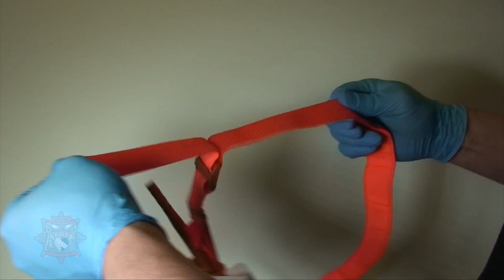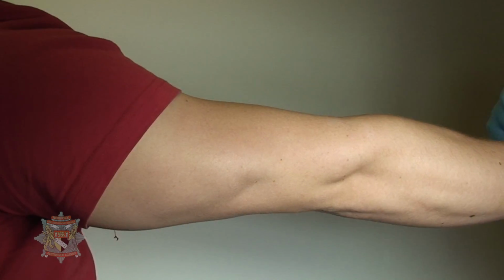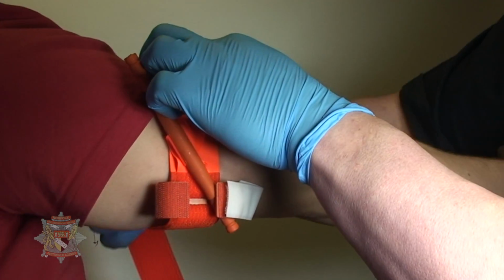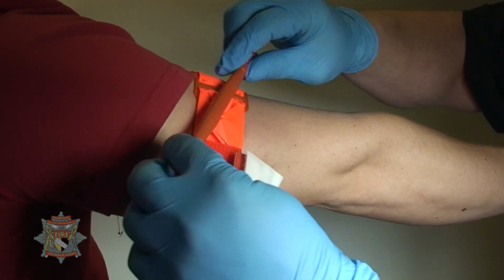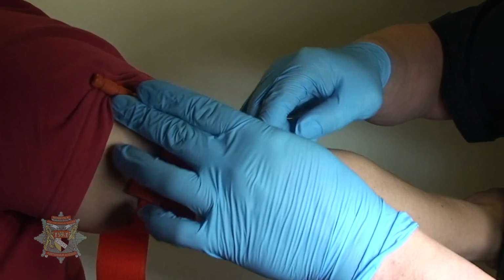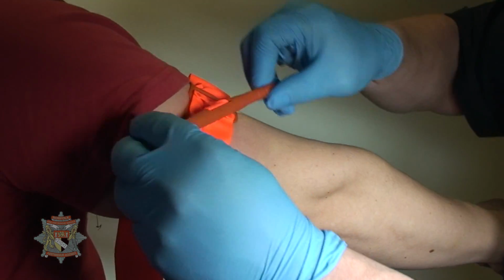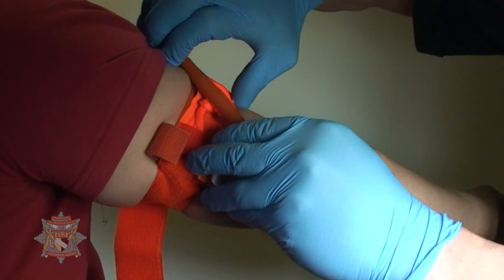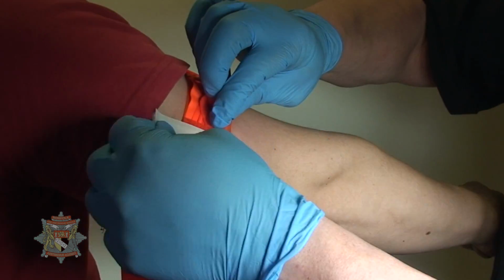Release the strap and pass the loop over the injured limb and position approximately 3 fingers width above the joint. Pull the strap tightly and fasten the band back on itself. Twist the windlass rod until bright red arterial bleeding has stopped and the distal pulse has been eliminated. Place the rod into the rod locking clip and secure in place with the tab.